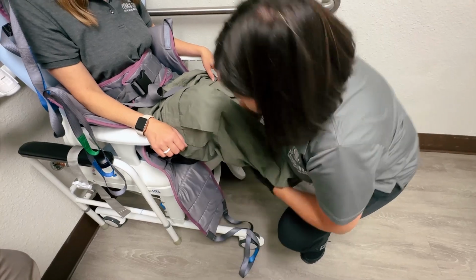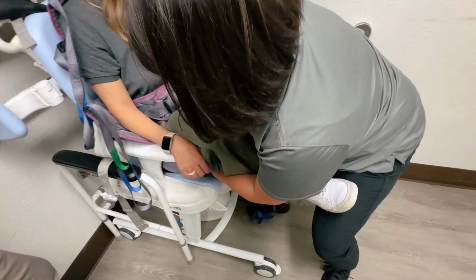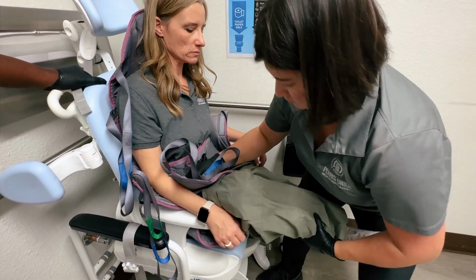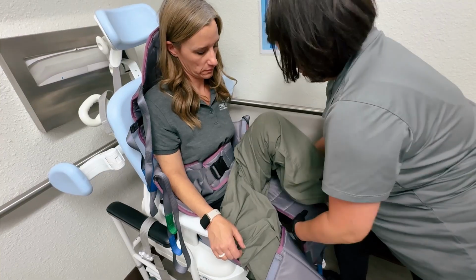When positioning the leg straps, make sure that the student's gathered brief and clothing are above the top edge of the straps to make it easier to pull the clothing up.